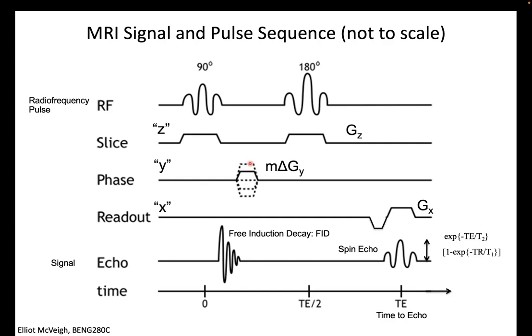We're going to apply a phase encoding pulse multiple times to the same slice, but with separate acquisitions, and add all those up. And then, since our signal decayed away so quickly here, we still have transverse magnetization. And so these gradients are still working to encode. Even though the signal looks like it's gone, the magnetization is there. They're just out of phase.